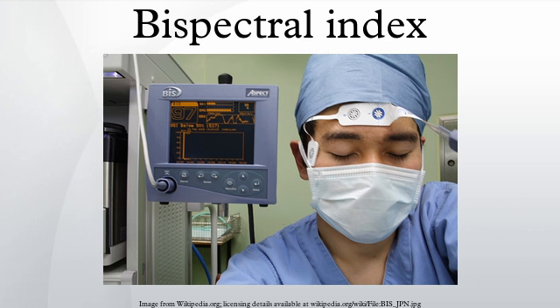BIS relevance. The BIS is an electroencephalogram-derived multivariate scale that correlates with the metabolic rate of glucose. Both loss of consciousness and awakening from anesthesia are correlated with this scale.